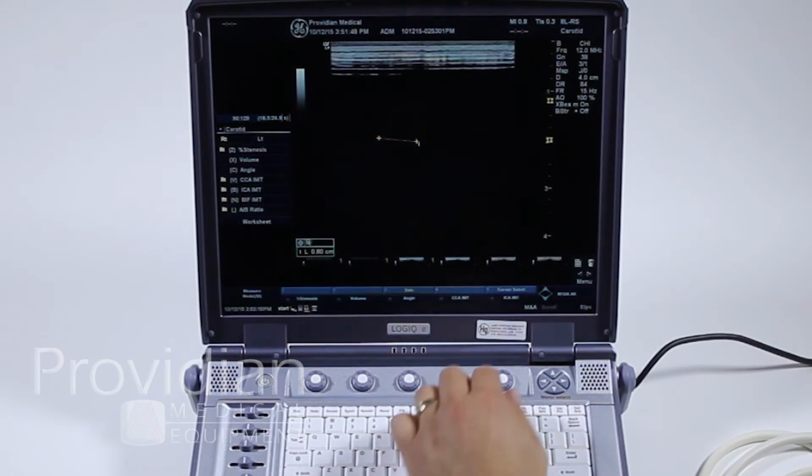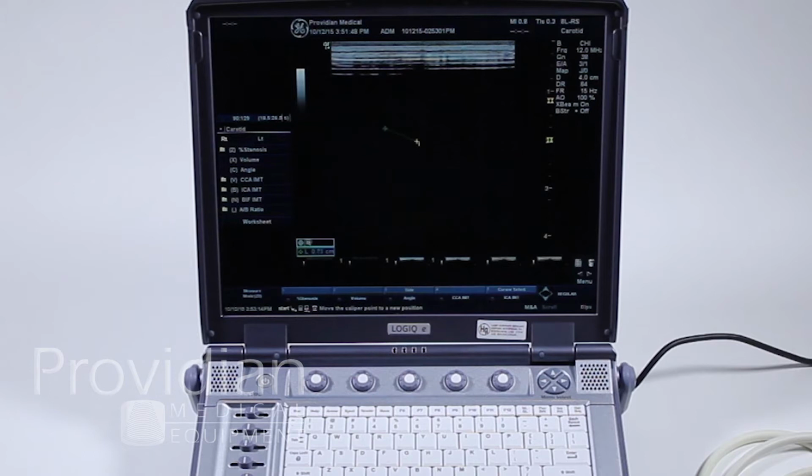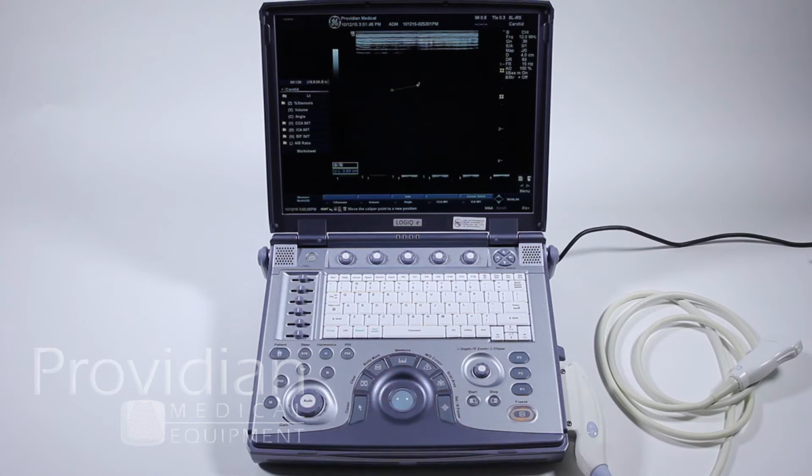Now if you want to go back and change that measurement again, you can twist this cursor select and it will reactivate that caliper. And then I can hit measure to go back and forth between the measurements. I hit set and then it saves that measurement. Press clear to get the measurements off the screen.